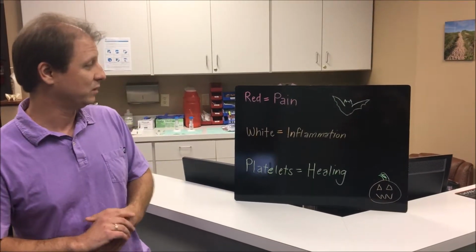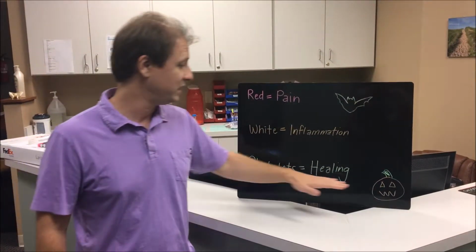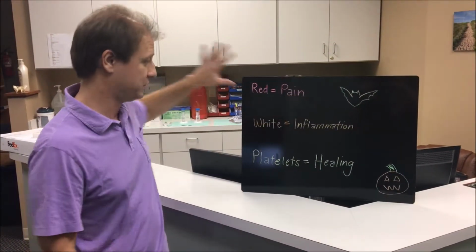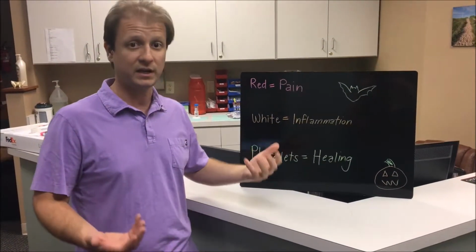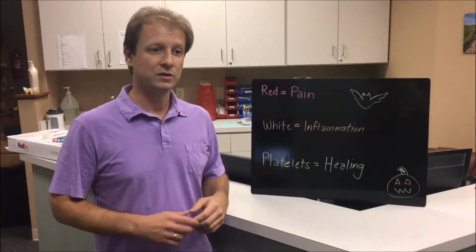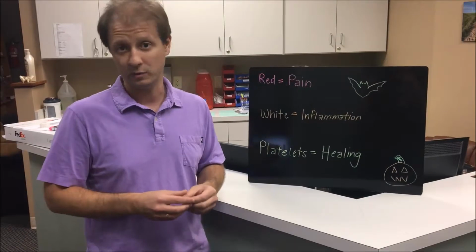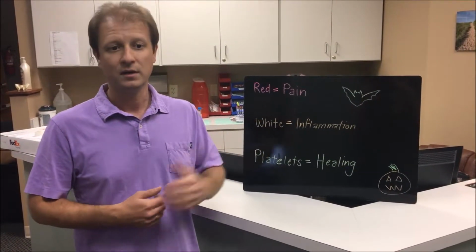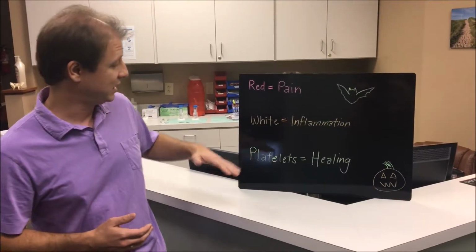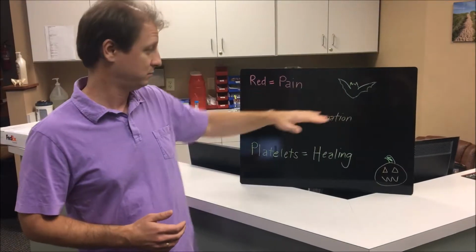So when we're doing platelet-rich plasma, we don't really want to cause extra pain. We don't want to cause inflammation in the system. What we want is just the healing response. So we take the person's blood and we spin it down, we separate out these three components and we remove these two. So all we're left with is the plasma, which is basically a carrier in this instance, and the platelets, which cause the healing. We also concentrate those. We take a large amount of blood and we concentrate all the platelets in that blood draw into a small amount that we can put in a small area. So the healing is compounded over what you would get just from a normal injury. The way I like to explain it many times is that we're getting the healing aspect out of an injury, but without actually injuring you.